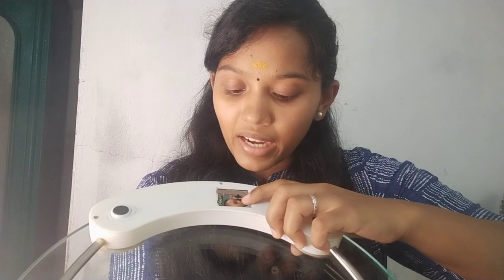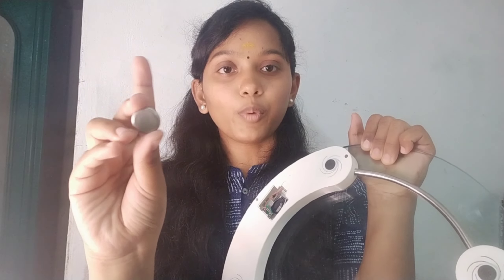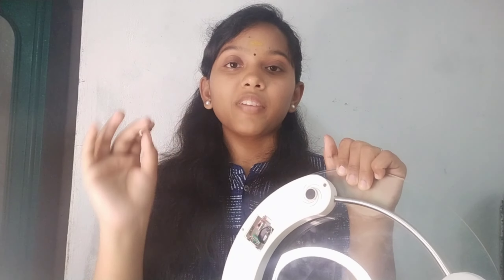There is a battery issue — we have to insert a battery in this case. We use 3 to 4 batteries for about 3 years. In the back, we have a lithium battery of medium size. The battery costs around 20 rupees — I found a pack of 5 batteries for 100 rupees on Amazon. This is how we change the battery.